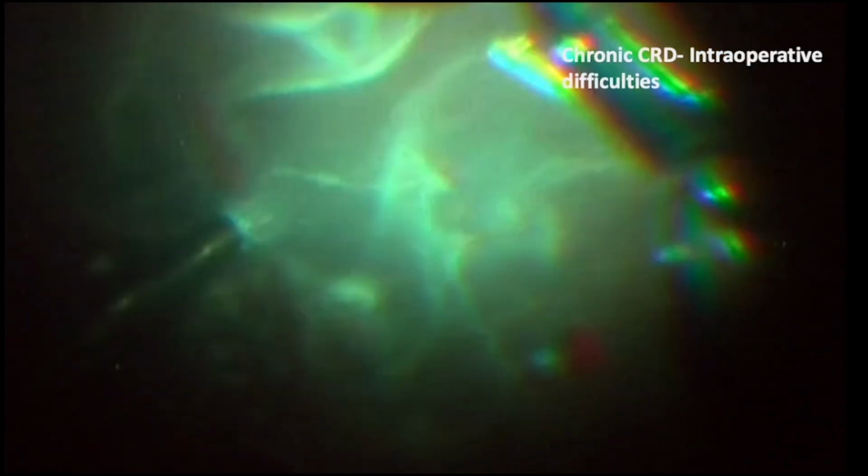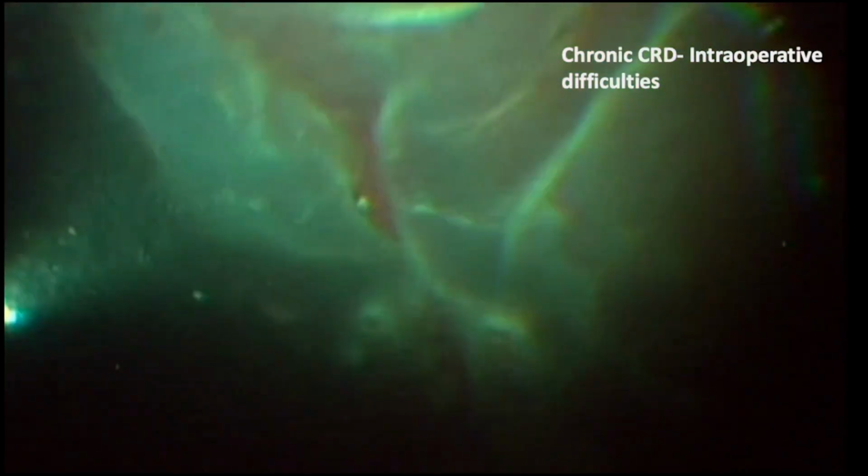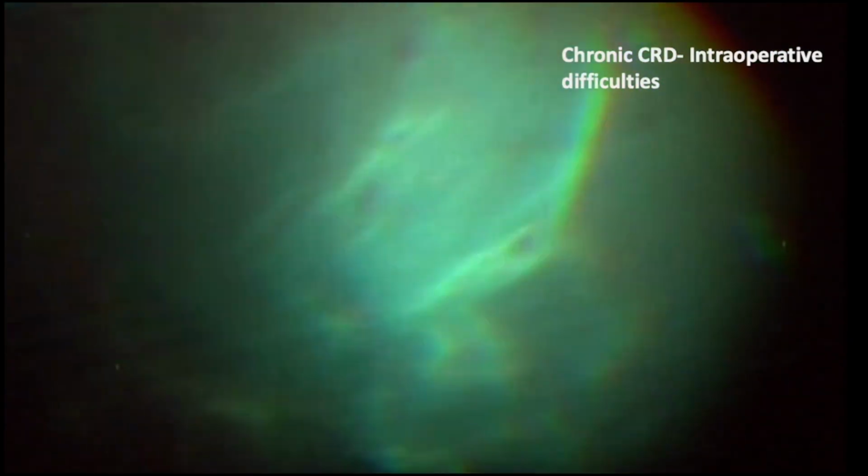Membrane peeling in a bullous retina might get difficult, but the vitreous separation in these cases has to be used to a surgeon's advantage. A proper peripheral dissection also is extremely important in bullous retina.